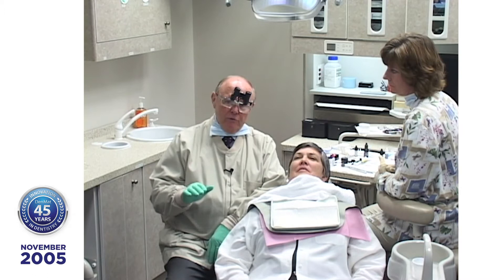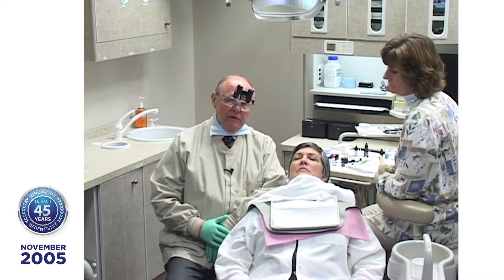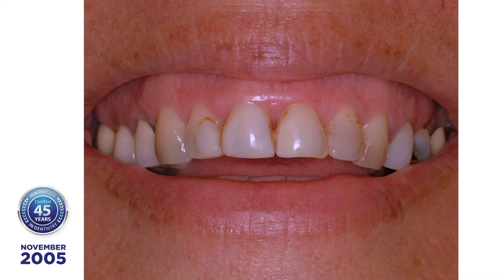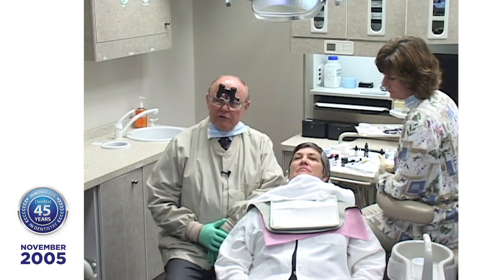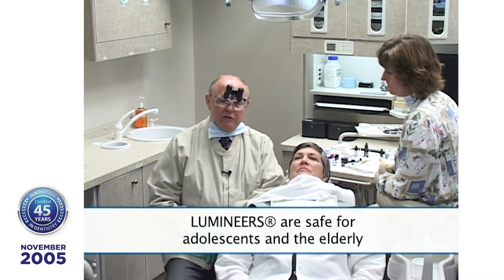We're going to place six lumineers on Beverly today. She's got teeth that aren't really bad — you wouldn't have them ground down if you had to, would you? Absolutely not. Every dentist has a Lumineer patient in their practice that hasn't been treated. You can use these on adolescents and older people. The whole process begins and ends without giving the patient a shot or anesthetic.